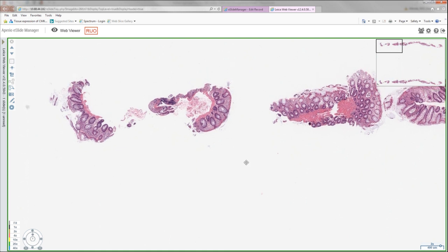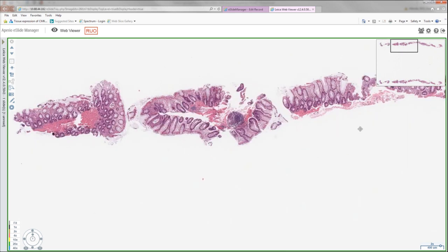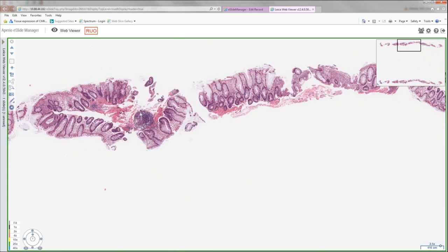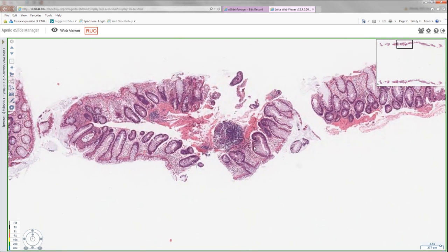And you can see how there are multiple fragments of colonic mucosa. Overall, I will say there is a normal architecture. There's muscularis mucosae with an even distribution of colonic crypts touching the muscularis mucosae, as we just saw. I want to highlight this area. This causes confusion sometimes. There's a slight, I would say, architectural abnormality here, but it's right above a lymphoid aggregate. So we're not gonna pay too much attention to that.